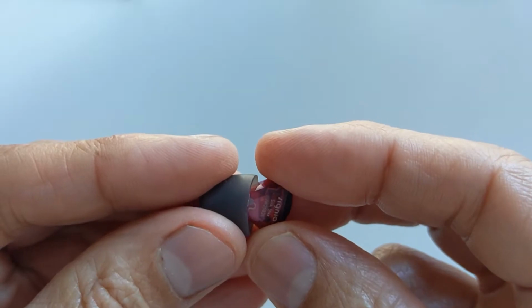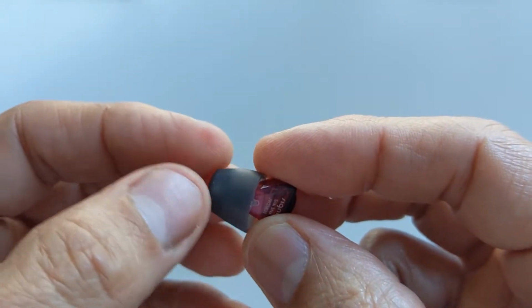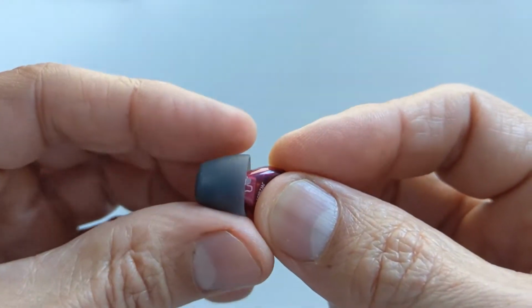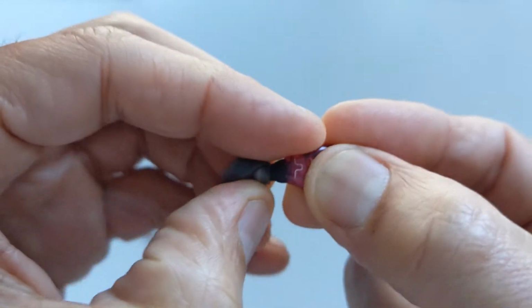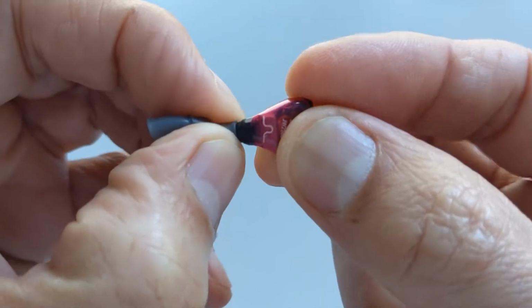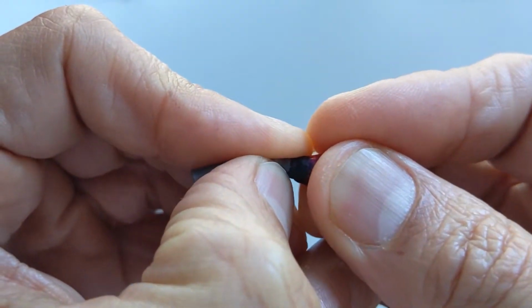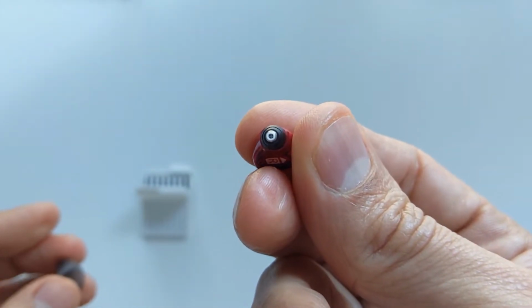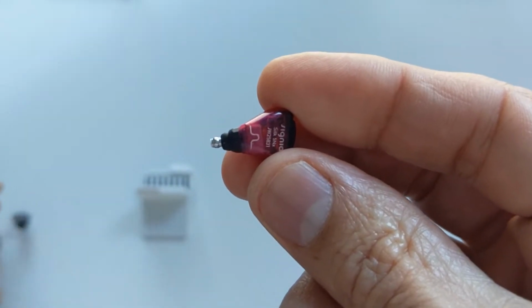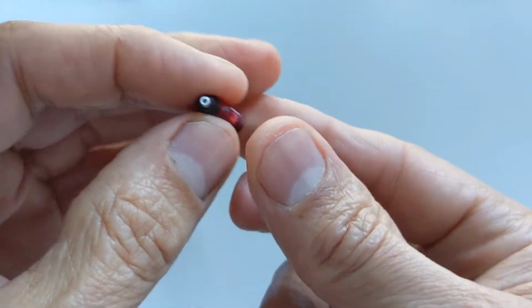Put that down there, and this is the Signia Silk hearing aid. What we're going to do first of all is remove the outer Signia click sleeve, and we'll just pull it inside out, which I find the easiest way to get a hold of the end. Grip it like so and pull it from the ball joint, and that will reveal the white filter in the end of this hearing aid that we're going to change. So I'm going to hold it like this.